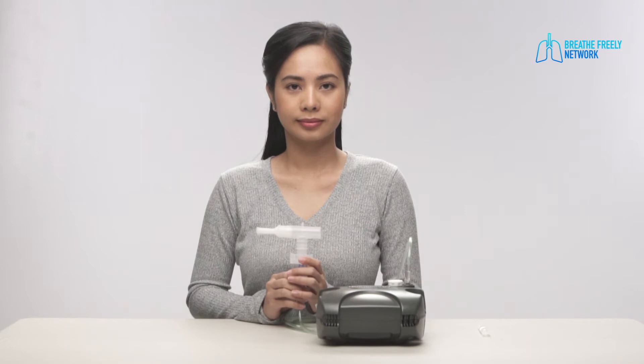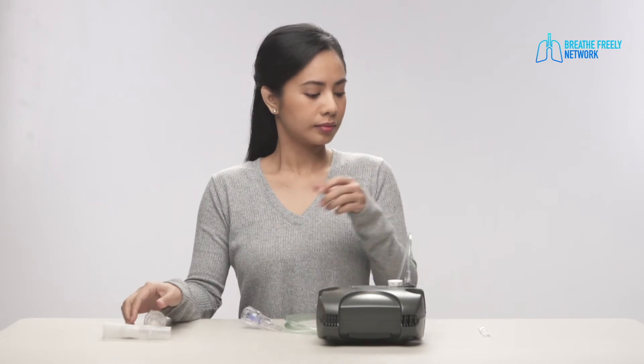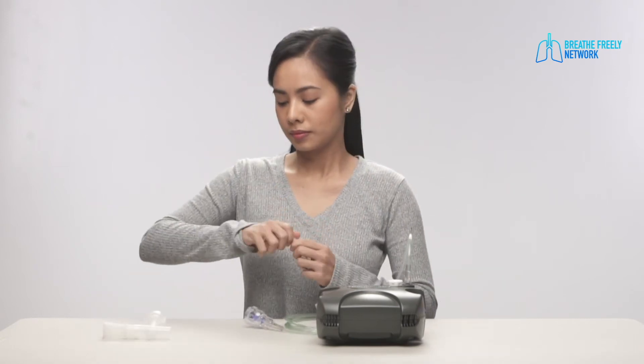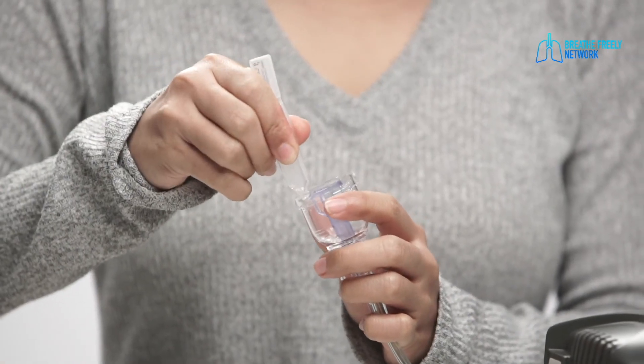Add the medicine to the medicine cup according to the doctor's prescription. Put the right dose of medicine in the neb cup. Some medicines come pre-measured — this is called a unit dose vial.